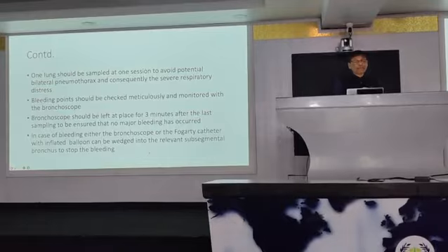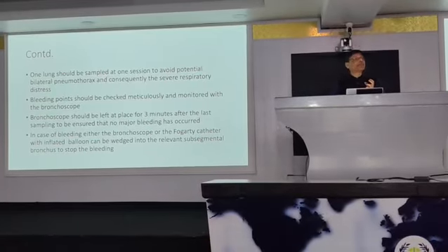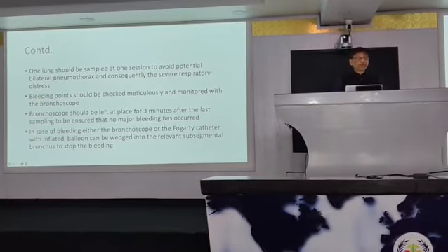One lung should be sampled at one session to avoid potential bilateral pneumothorax and consequently severe respiratory distress. If there is bilateral pneumothorax, it will be a problem. So do one lung at one time.